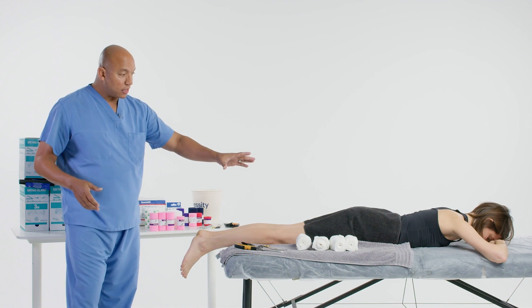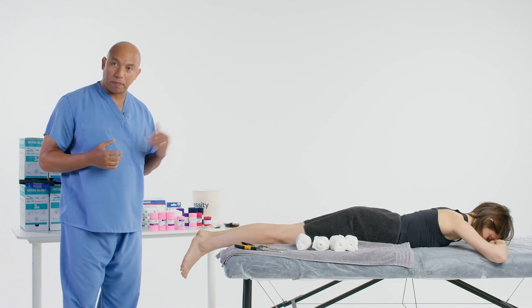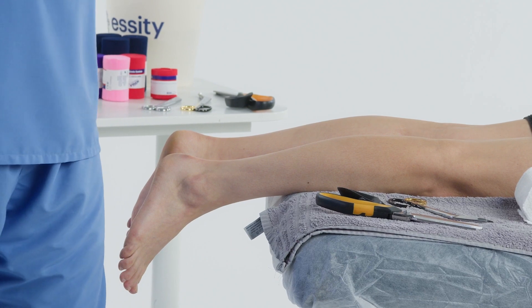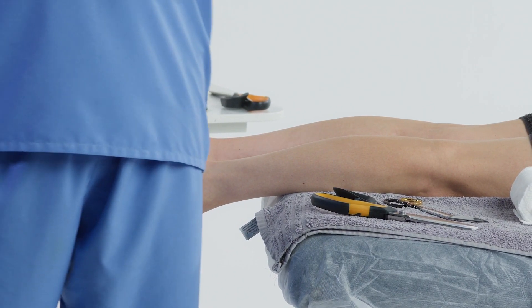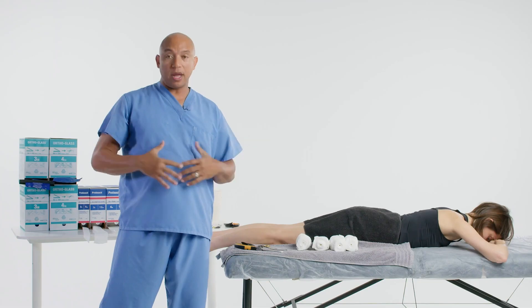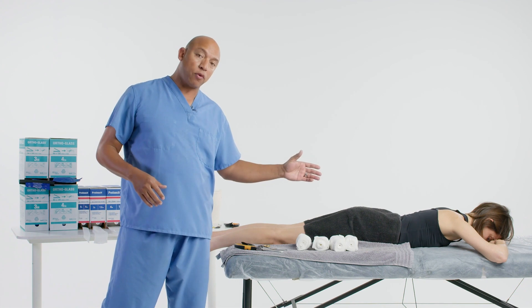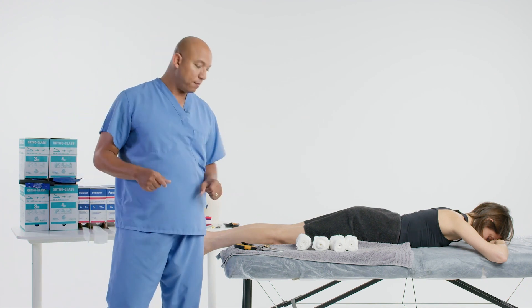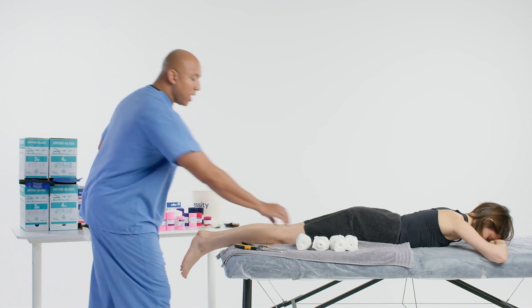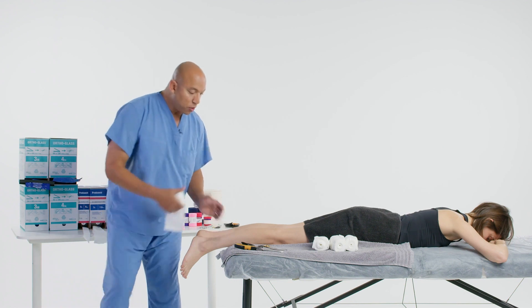We also have what we call a prone position, where the patient is laying down and we're going to use gravity to help us apply this splint. If the patient is laying on their stomach and has troubles breathing or is with child and far along, this may not be as comfortable, but this is going to be the easiest for the clinician to apply.